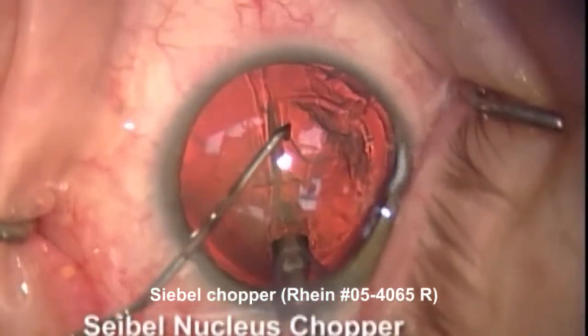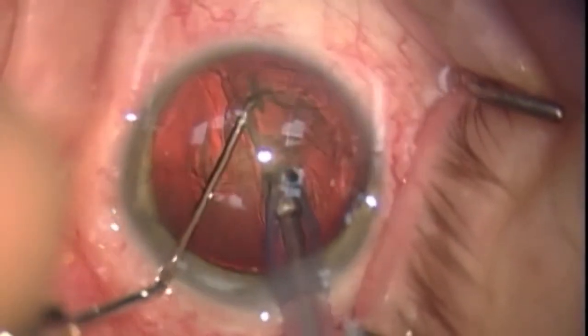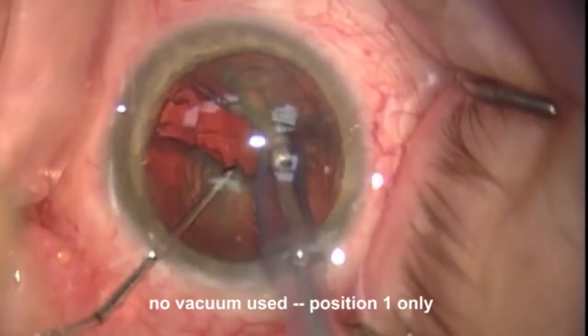The idea here is that we're going to use the chopper and the FACO needle, but have no vacuum at all on the FACO needle, so that we don't have to worry about punching through accidentally.